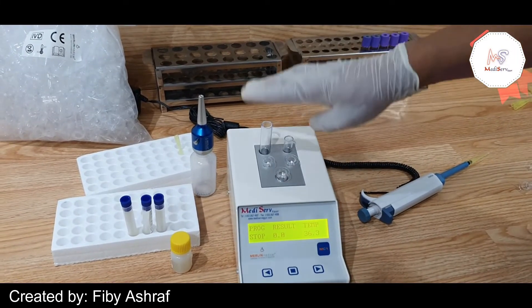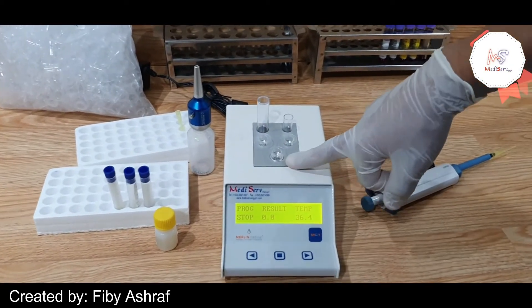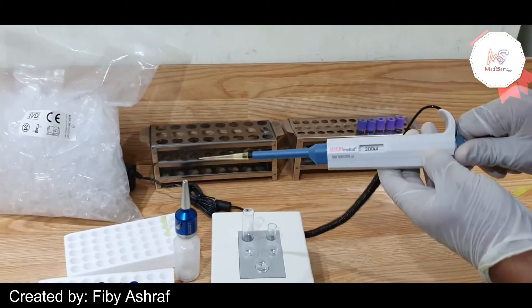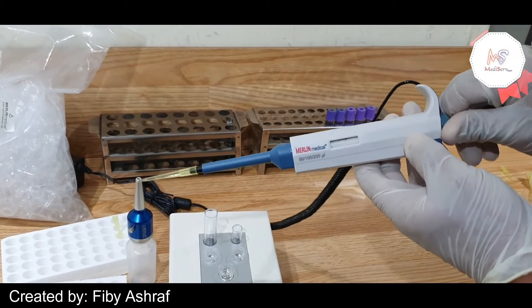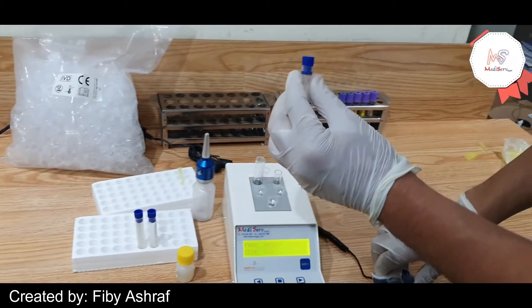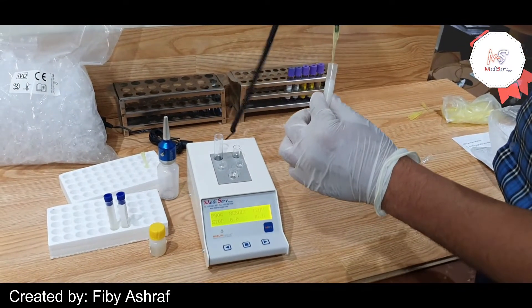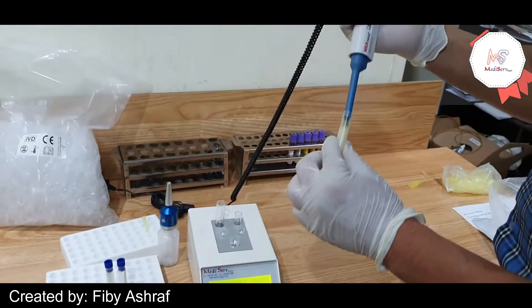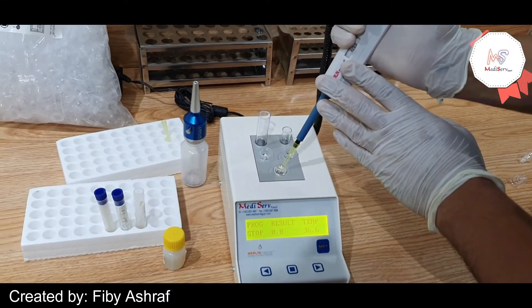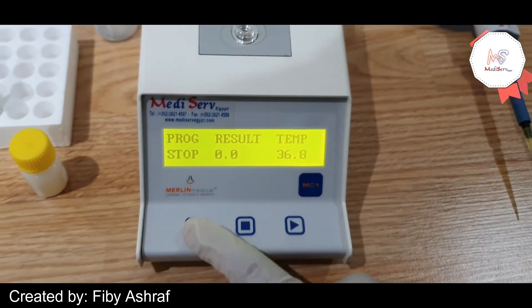After placing the cuvettes and the sampling tubes in the incubation area, and before starting the incubation cycle, we add the sampling test to one of the cuvettes.